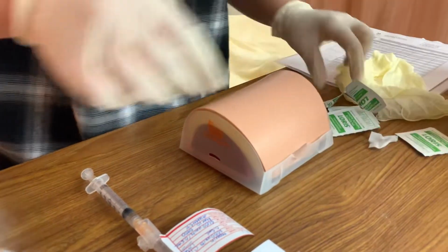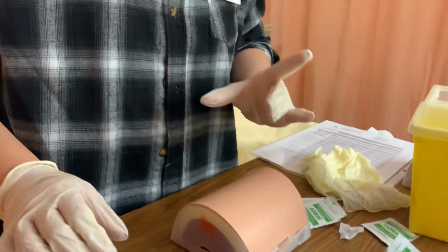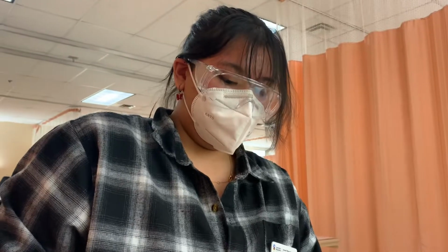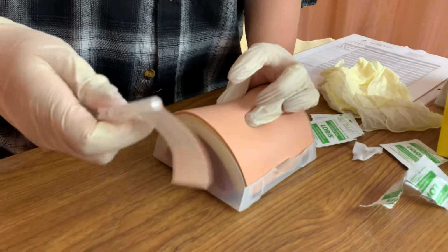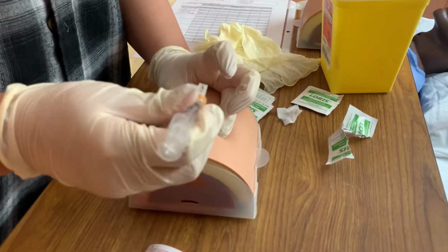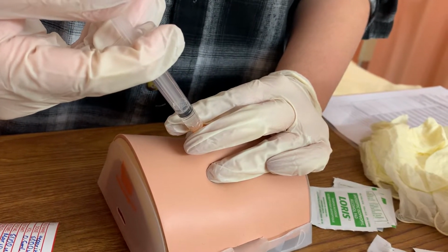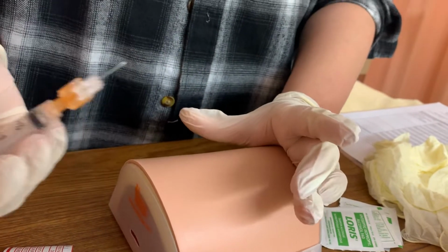Perfect. Okay. So while that dries, I'm going to be pinching your skin. This should not hurt. It is a relatively short needle. You may feel a little bit of a pinch, but it shouldn't be too bad. So I have pinched about 1 inch. Yeah, that's 1 inch. And so I'm going to open my needle. I'm going to inject it at a 45-degree angle because this is about 1 inch. Here. There you go. I'm going to stabilize it and I'm going to inject it. Perfect. Okay. Now I let go afterwards.